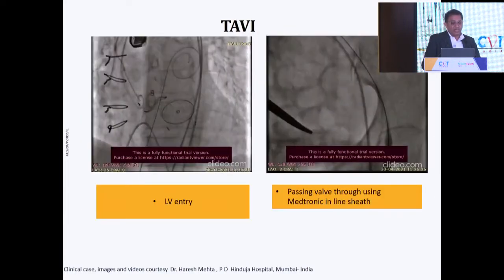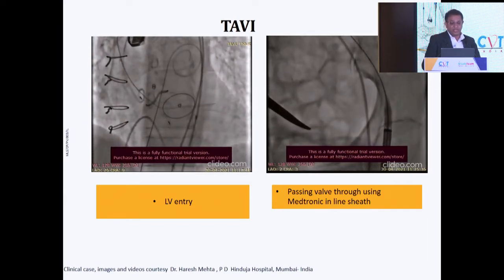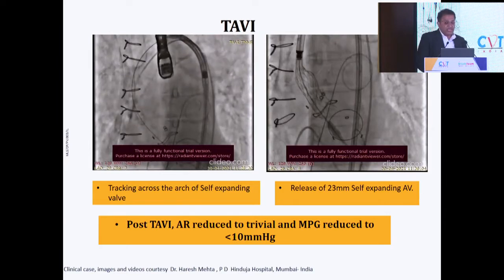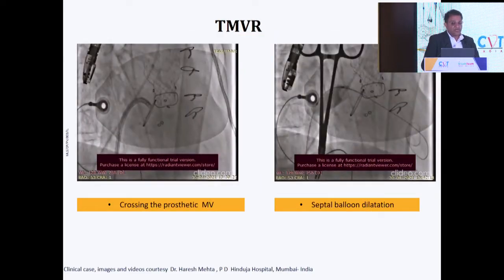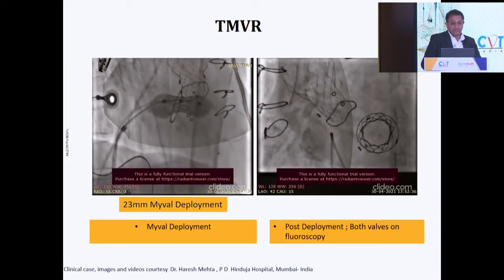TAVI was a regular procedure. We crossed the regular way and we used a 23 Evolut and deployed it almost at zero. We got a gradient of less than 10 millimeters of mercury. And then we went across with a TMVR using the Agilis sheath. We easily crossed the valve. We did a transseptal puncture. And there's the TMVR.